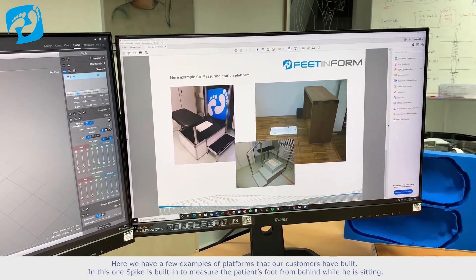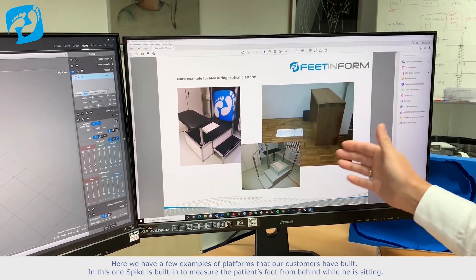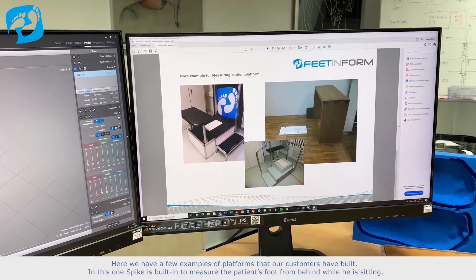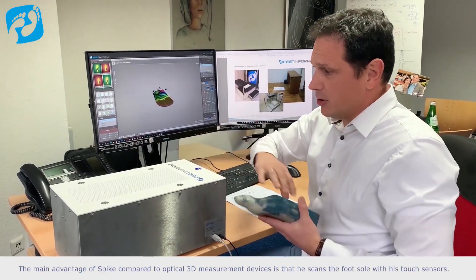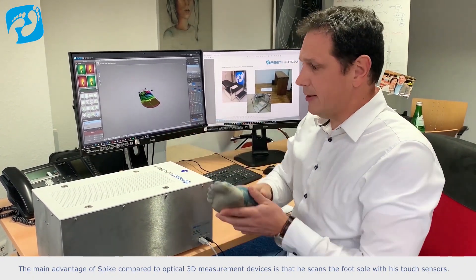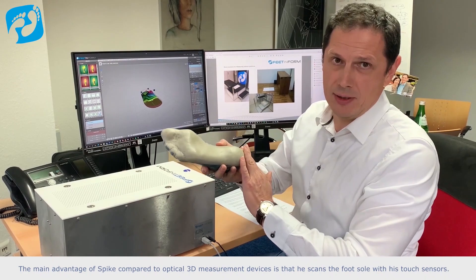In this one, Spike is built-in to measure the patient's foot from behind while he is sitting. The main advantage of Spike compared to optical 3D measurement devices is that it scans the foot's sole with its touch sensors.